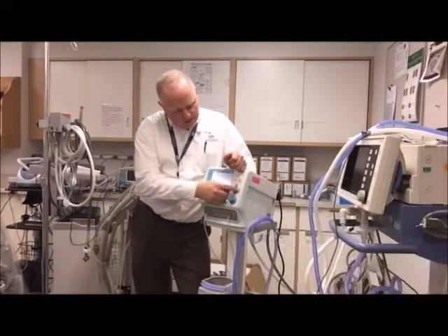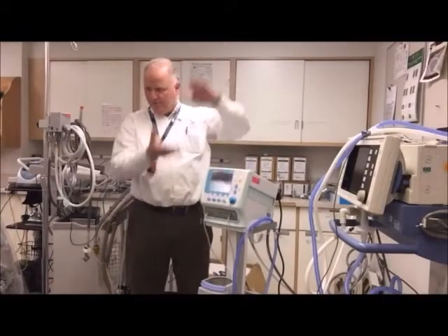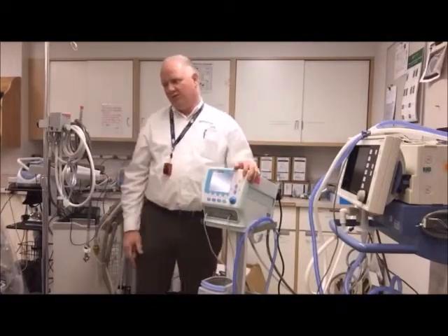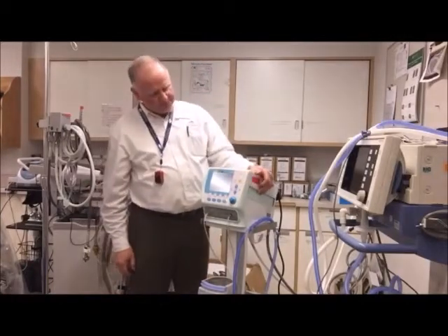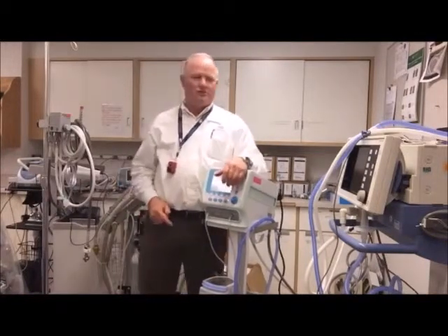From there I can change my sweep — make it narrow or wider — and I can also scale it to get a better look at those waveforms. I can even freeze the waveform for evaluation. The oxygen flush is adjustable, so it's not fixed at 100% — it's whatever you set it at.